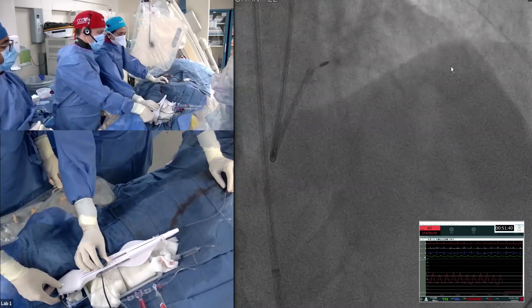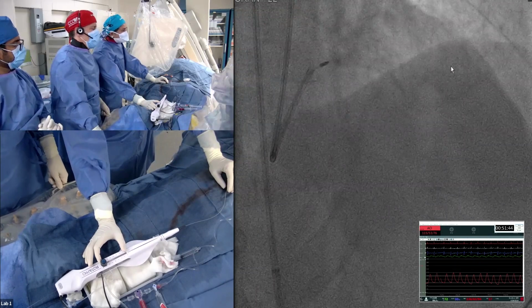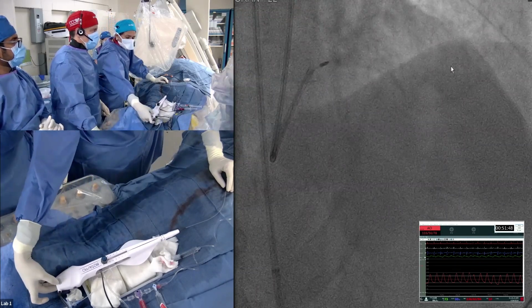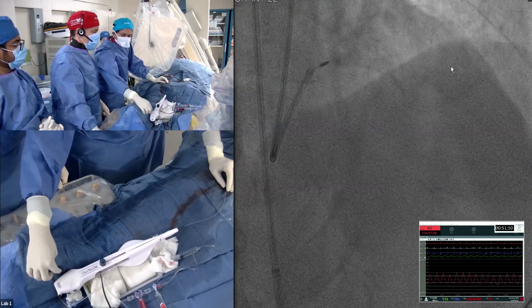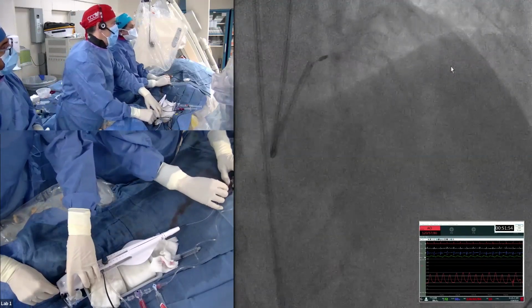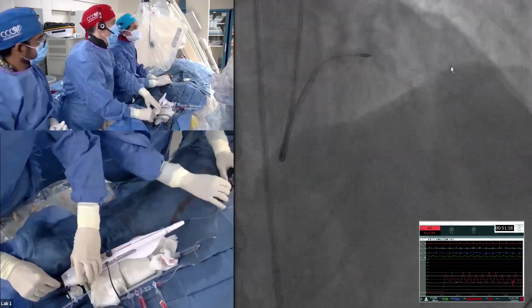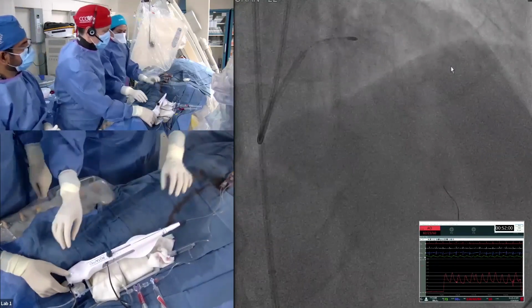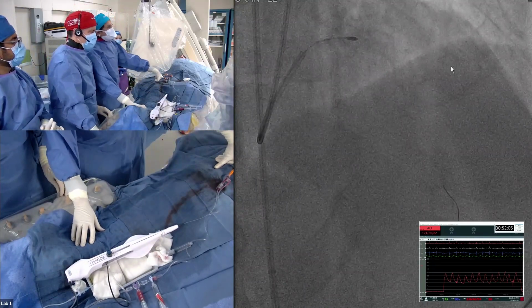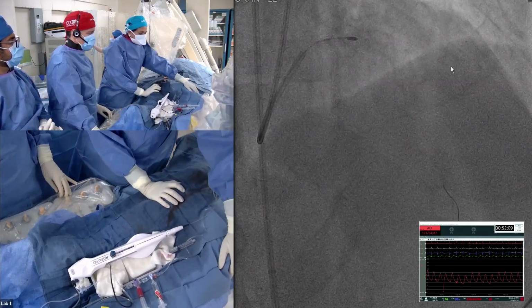So you see here, this is about 9 centimeters, so you have that much space. What I will do is go forward on the Dynaglide. If you have to do that, you go on Dynaglide, do brake release. Joe is going to do brake release, and this knob is tight, and I'm going to go forward on the Dynaglide. Go. This is the same trick you would use if you were a single operator trying to bring the burr up. Yes. You see this trick. This is really, really important trick here: the 3 steps, and then using Dynaglide to go forward.